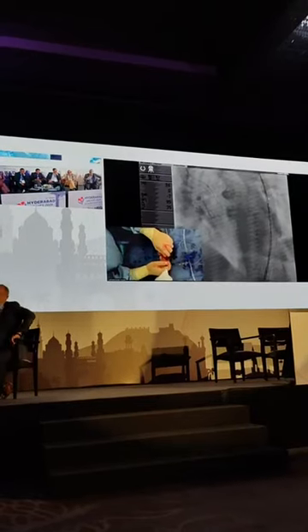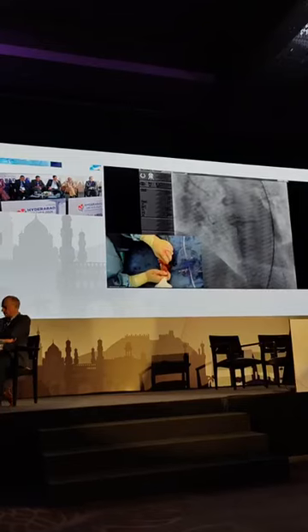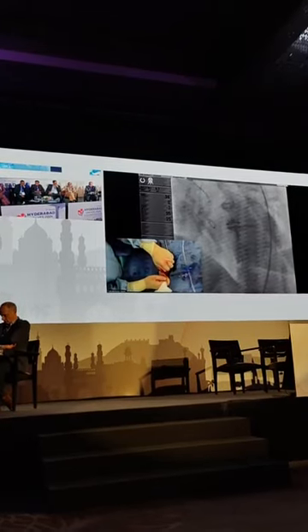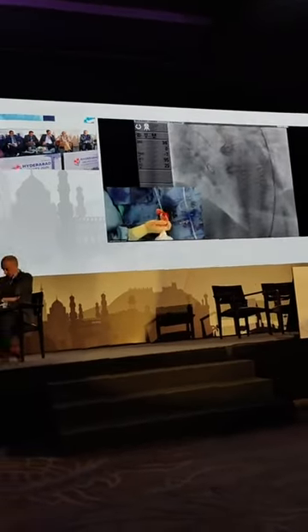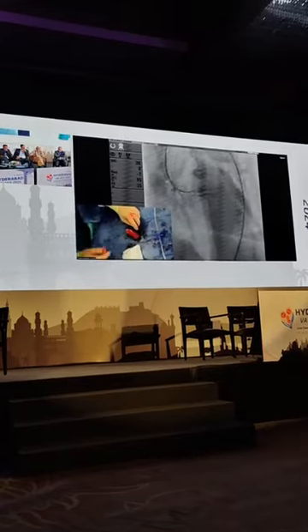So you try not to miss the hole, but you don't try by figuring out where is the hole. You just do the maneuver. So I have to do it again.